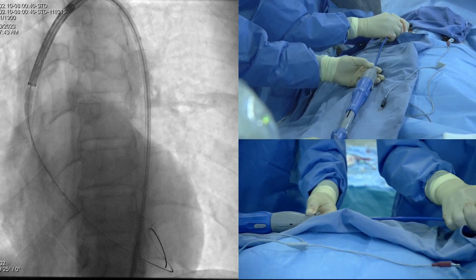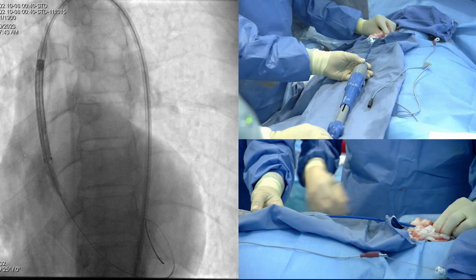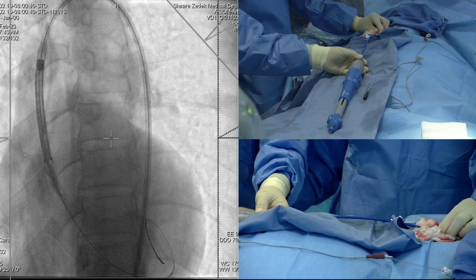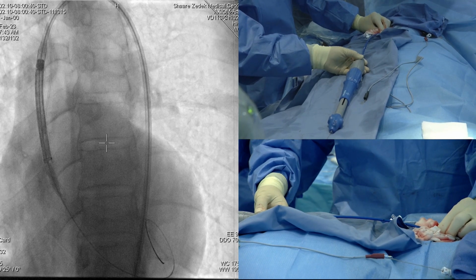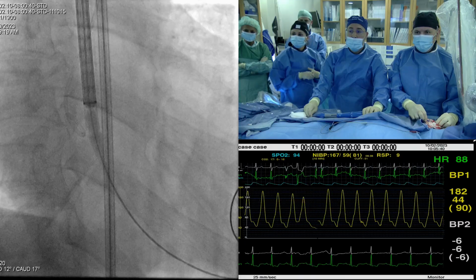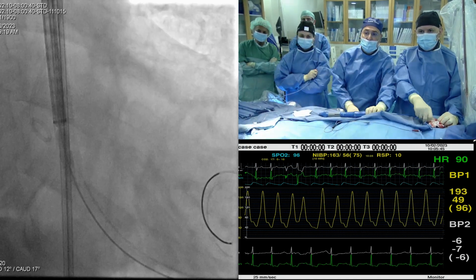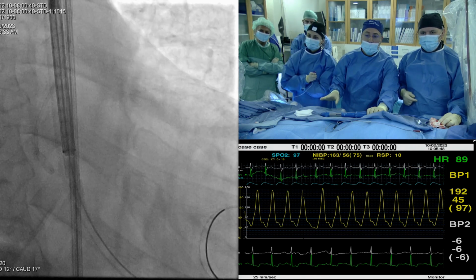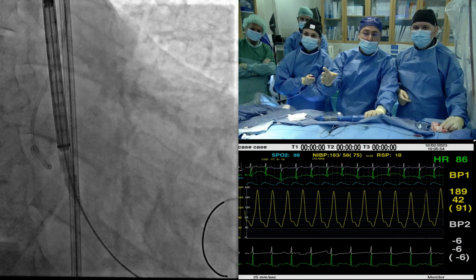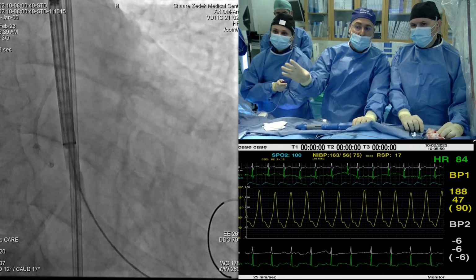So in the case today, no doubt that the Pro Plus enabled us to get an external skirt device. Okay, we can go to a device with external skirt that will still have a label for 5 millimeter. We don't have it with other options. This is a mid-septal position for the top hat, and the top hat morphology is good for cusp overlap. We are in RAO caudal, in the view where the non-coronary cusp is alone on the left side of the screen, and the right and the left are together on the right side of the screen with the raphe between them.